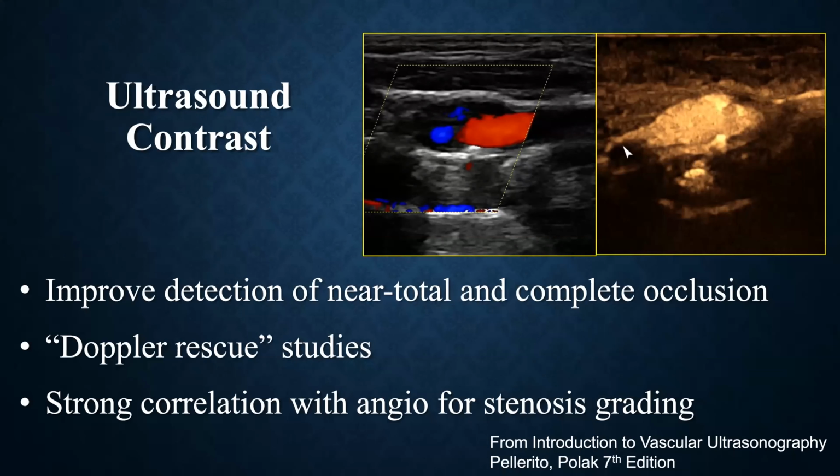So we're starting to get more comfortable using ultrasound contrast for these vascular applications. We're finding that there is a good correlation between ultrasound contrast studies and arteriography for stenosis grading, and I expect that we'll be using this more in the future.